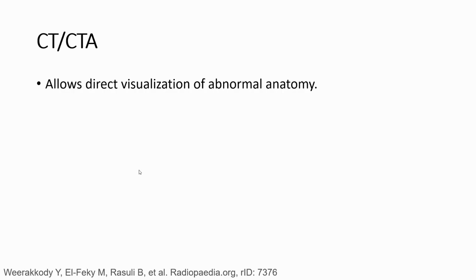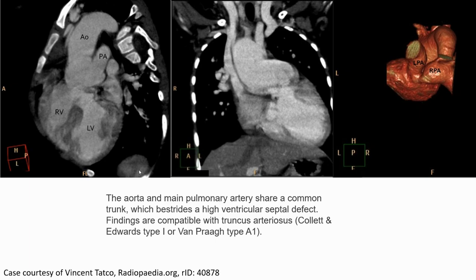In CT or CTA, there is direct visualisation of the abnormal anatomy of truncus arteriosus. This set of CTA images shows the aorta and main pulmonary artery sharing a common trunk, with a high ventricular septal defect. The findings are compatible with truncus arteriosus, Collett and Edwards Type A1.